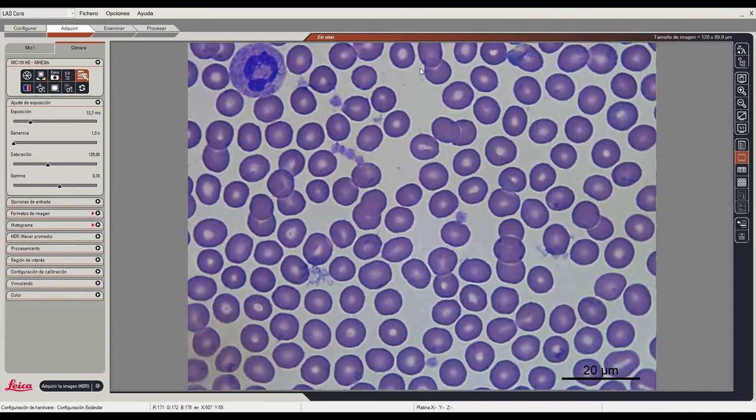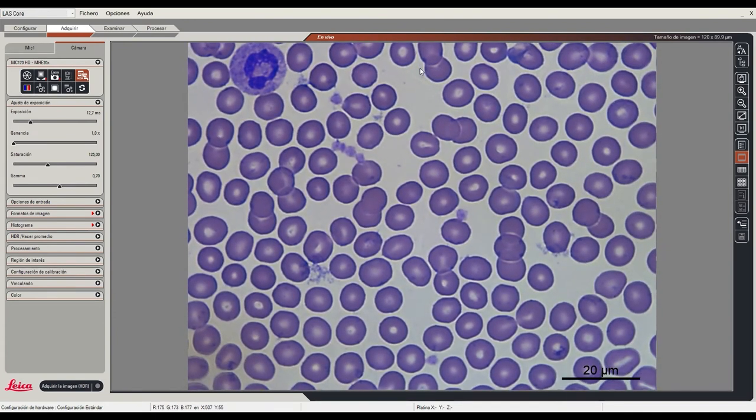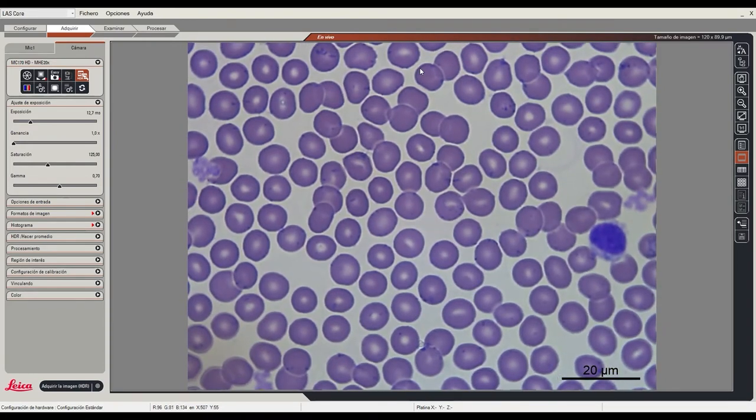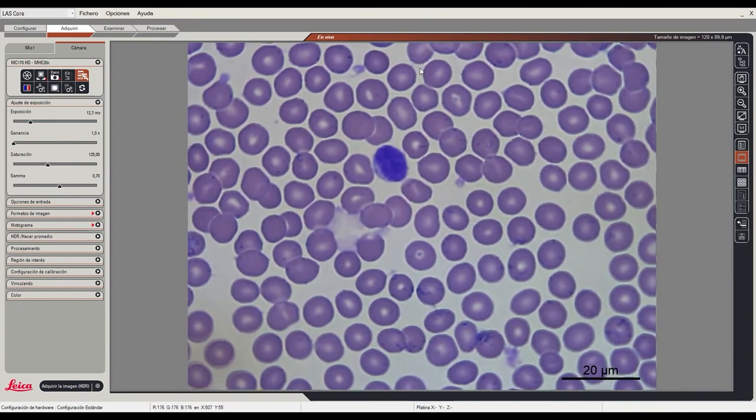Under the microscope, erythrocytes are pink, while leukocytes show much more intense purple or lilac staining. The regions between the cells are clear, with no visible film or dye.